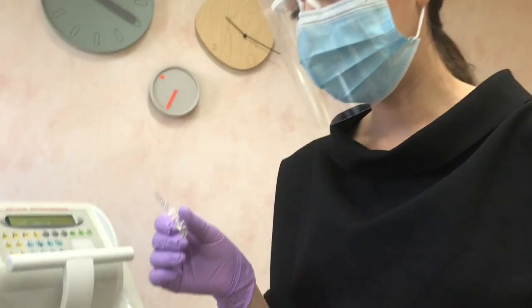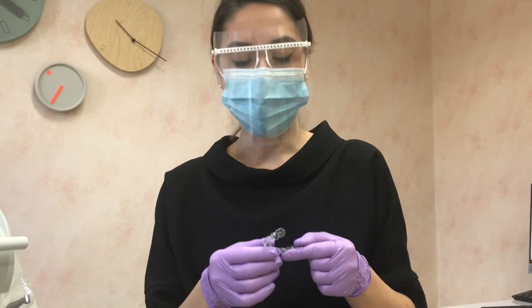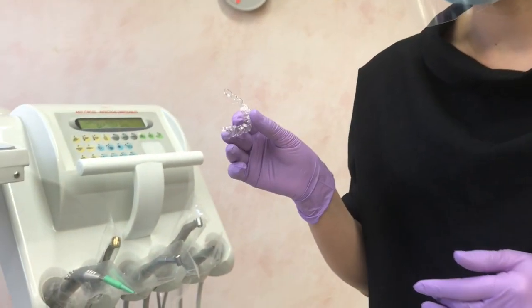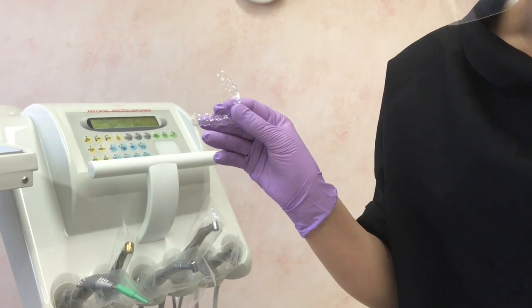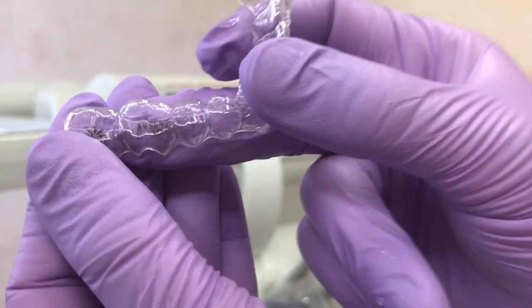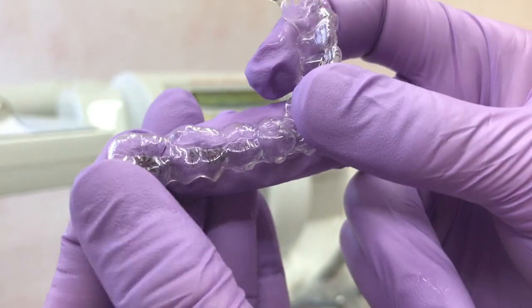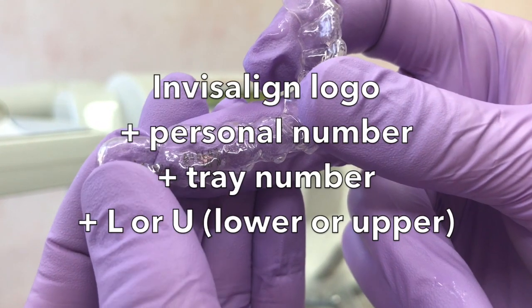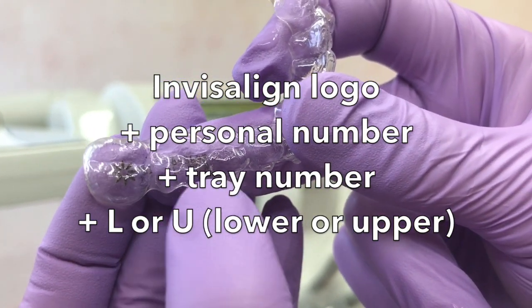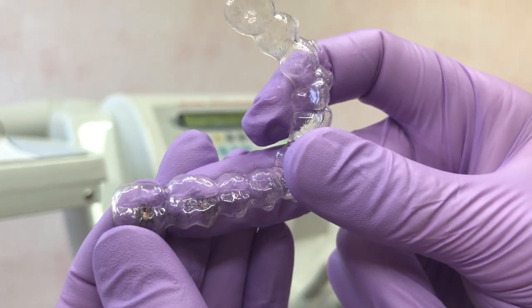On each aligner you need to know that you are going to have the number of your aligner, and also the letter L for the lower arch and U for the upper arch. On this part you have the Invisalign logo, your personal ID number for your Invisalign account, and L lower 10 number. So it was tray number 10.